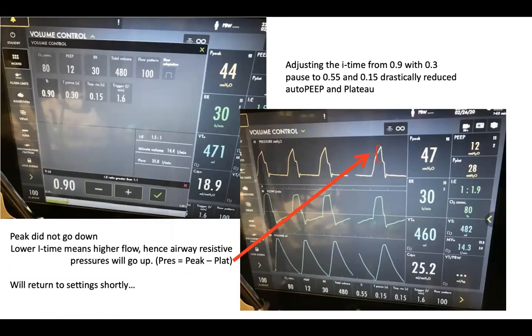By simply reducing the I time, which does mean higher flow, and reducing both the set I time and that long protracted pause, you can see that there was a 1.2 second I time set, and if you drop it to half that, you can drastically reduce the auto-PEEP and the plateau pressure.